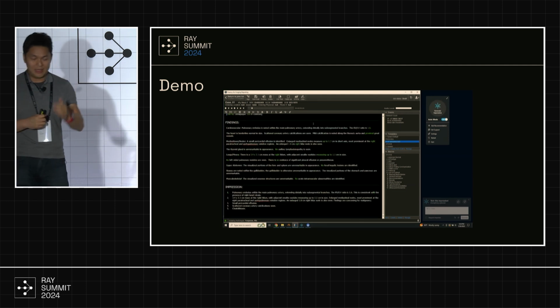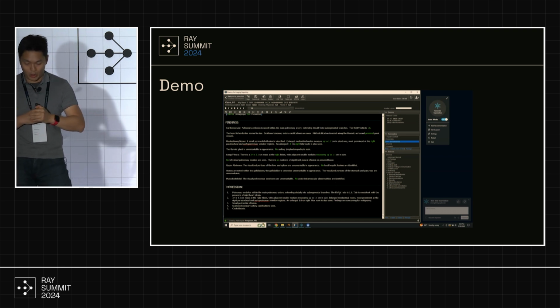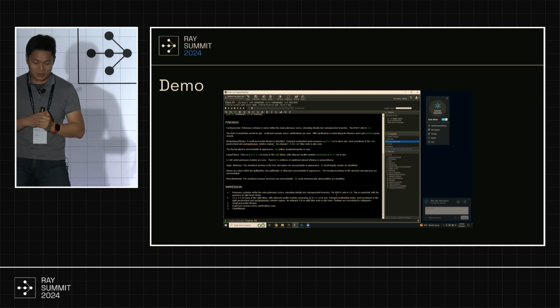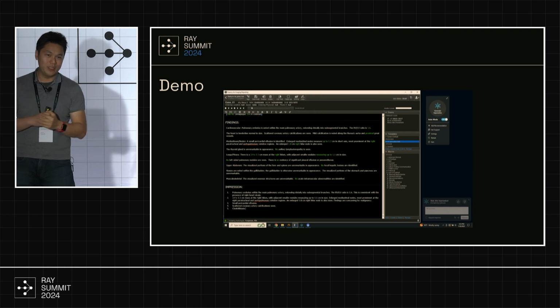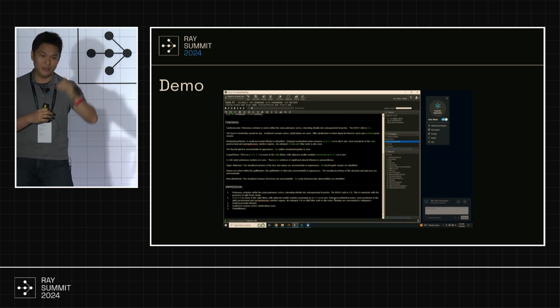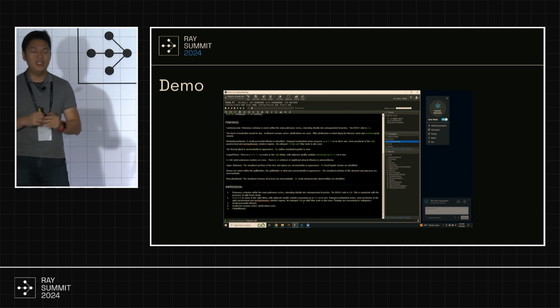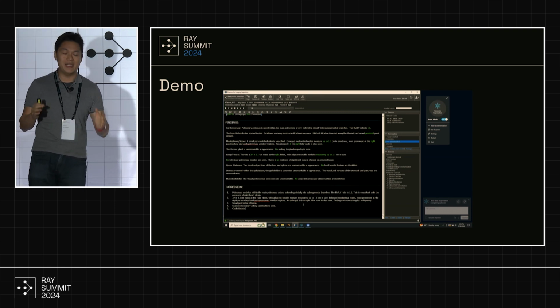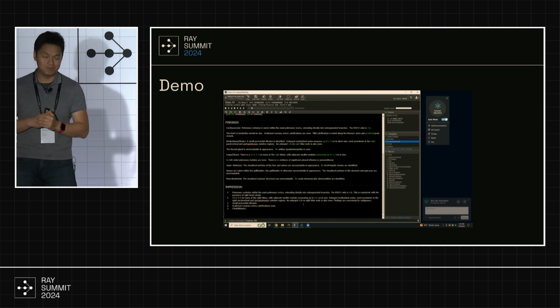You can probably see that the impressions down there are not made up. Right, the RV-LV ratio is about 1.6. You can see that reference in the impression section as well. Those of you who have really good eyesight can actually try to check. We marked the key ones in green. You can check, those are all reflected in the proper specifics in the impression section. This is really important. We need to make sure that the impression section is highly accurate, and we also need to make sure it's customized to the radiologist's style.